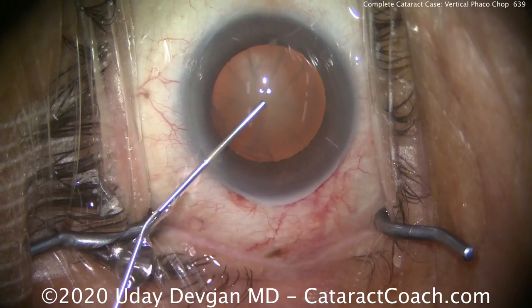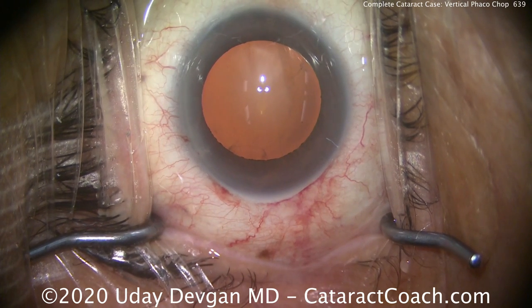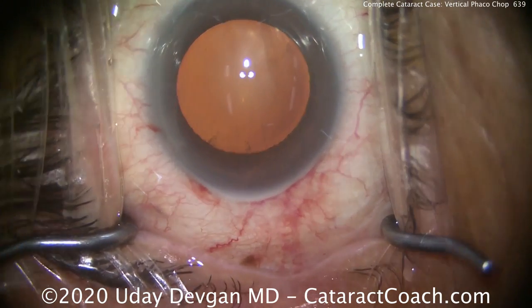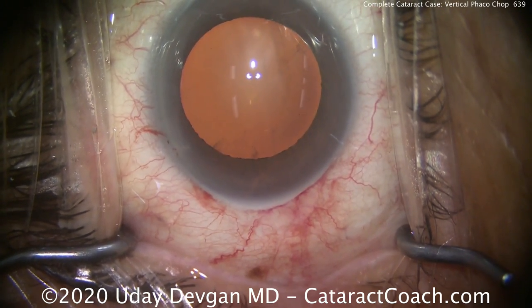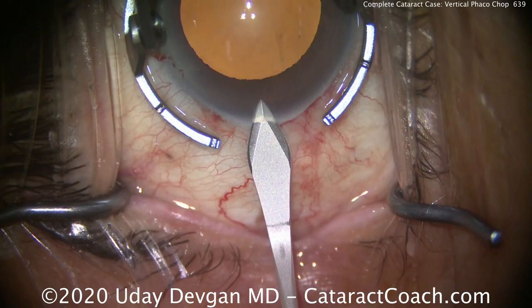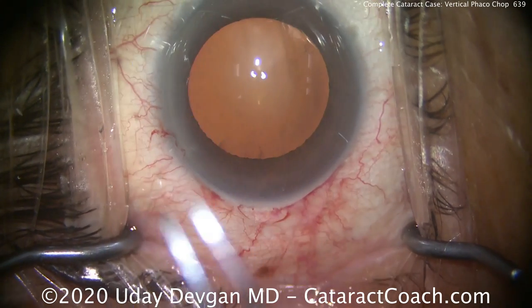Let me show you a traditional case here — a vertical chop. There we see the patient is nicely draped, eyelashes out of the way, lid margins sequestered, eye in primary position. We just filled the eye with viscoelastic. Time to make our main incision here. Let's zoom in a little bit and get the focus just where we like it. Here comes the fixation ring, and then using a slit keratome in this case. There's a very nice incision — good tunnel length. That's a 2.4 millimeter wide incision.